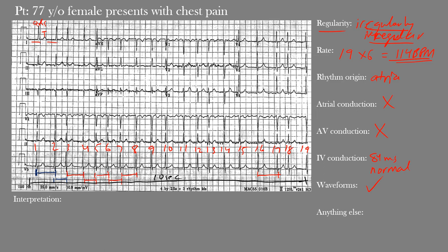Is there anything else we're missing? There is one minor point to be aware of: the baseline is not isoelectric in some areas. This may be due to skeletal interference, or more likely in this case it's due to chaotic atrial activity. If you notice here, the baseline is not flat in places, and that's more likely caused by chaotic atrial activity with no clear atrial contractions or atrial depolarization, which is consistent with us being unable to make out any P waves.